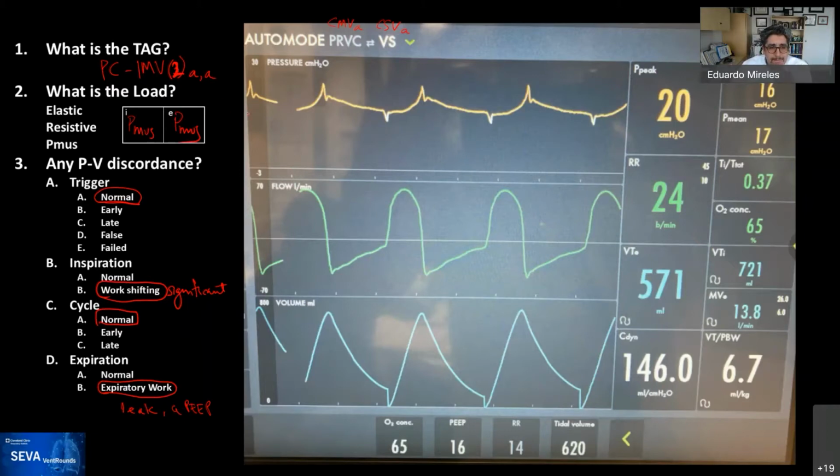Just a nuance here: ventilators do it different ways, but when we say that type 2 suppresses based on frequency, it's really based on the total cycle time, right? Because frequency is 1 over the total cycle time. Yes. So it looks at the expiratory time, adds it to the inspiratory time, and if 60 divided by that is greater than the set frequency, that's how it works. In other words, it doesn't count 60 spontaneous breaths, or a whole minute's worth of spontaneous breaths, before it starts suppressing mandatory breaths.